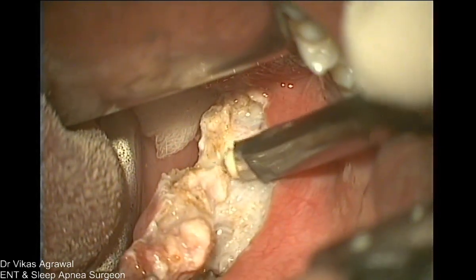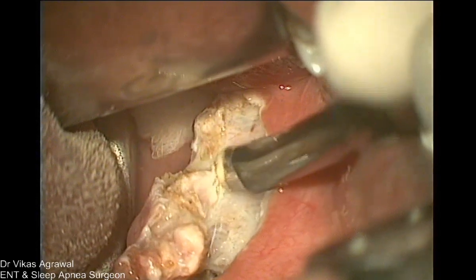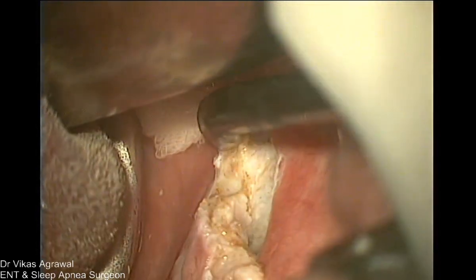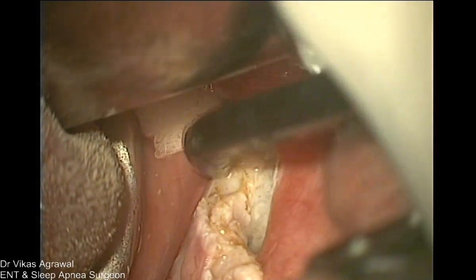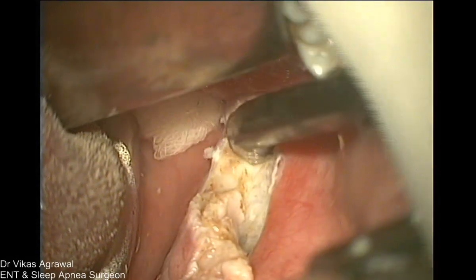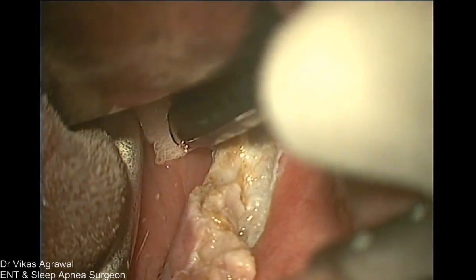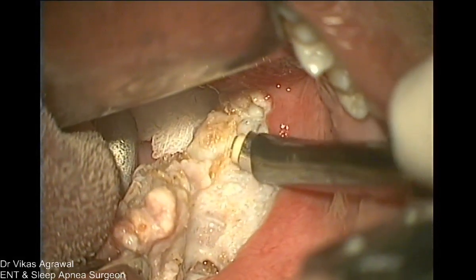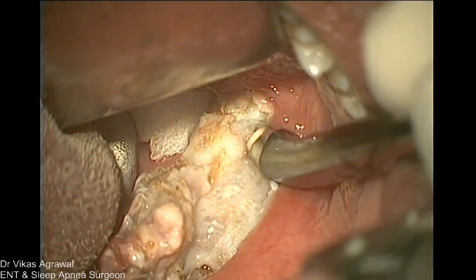Okay. See, I have just left a little bit of tonsil, and that is by design. I mean, you want to leave a little bit of tissue there. See, this is not a case of tonsillitis. This was a case of sleep apnea, and I'm just not exposing my tonsillar artery.